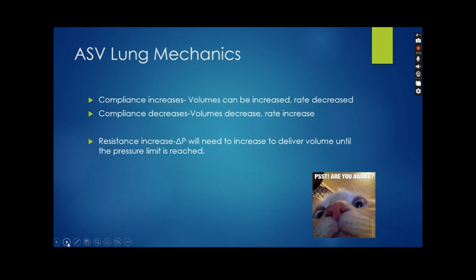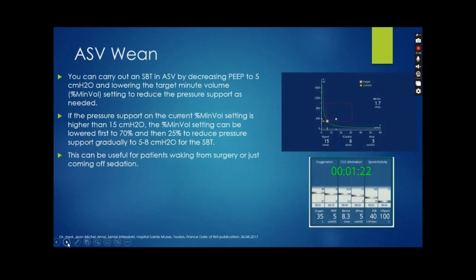So that is how the vent works with the patient, depending on their compliance, their resistance, and that patient's effort. It's a constant adjustment that the vent is already making that we don't have to constantly assess and make on these patients, especially if they're considered unstable.